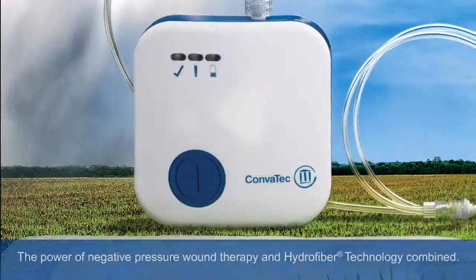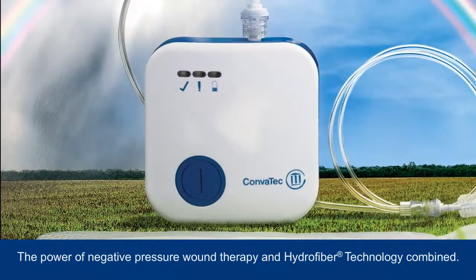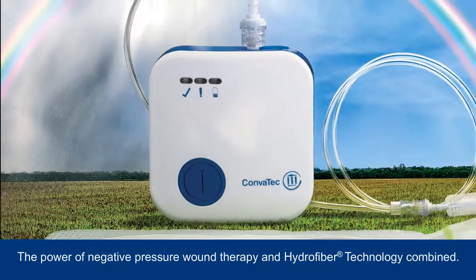The innovative system brings together the power of negative pressure wound therapy and hydrofibre technology, which is designed to help create a moist wound environment for healing.